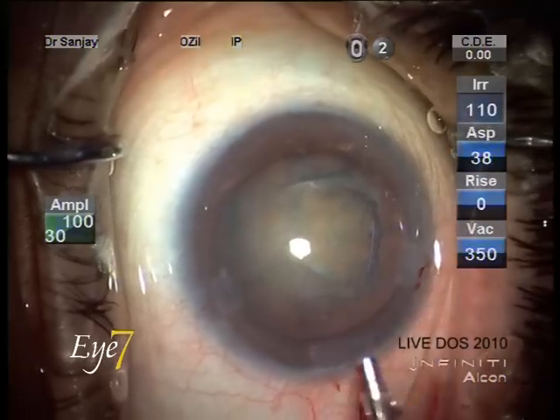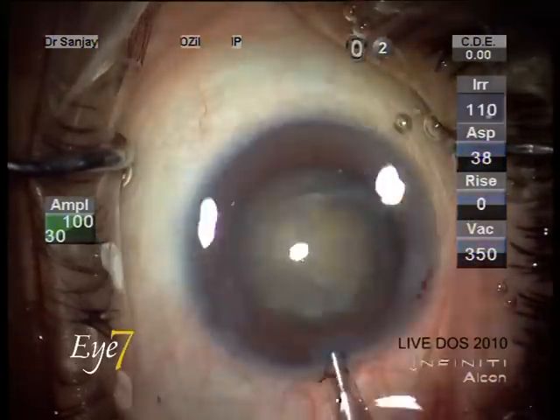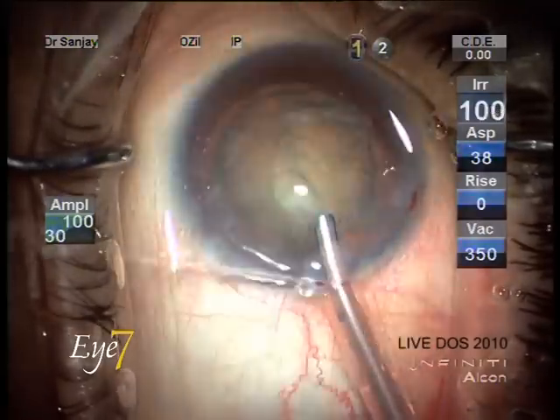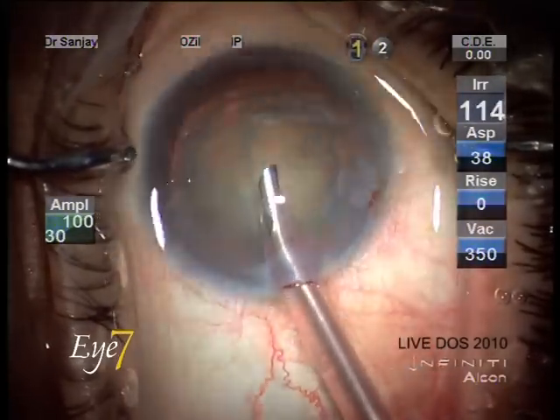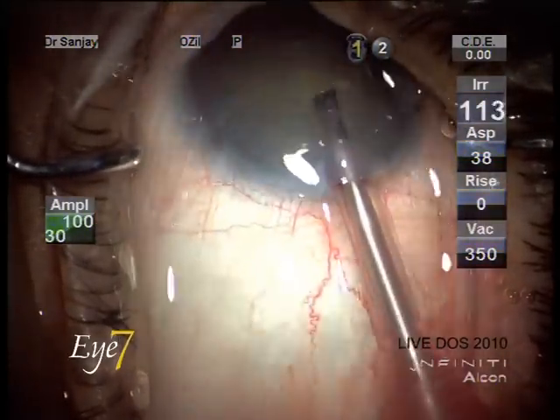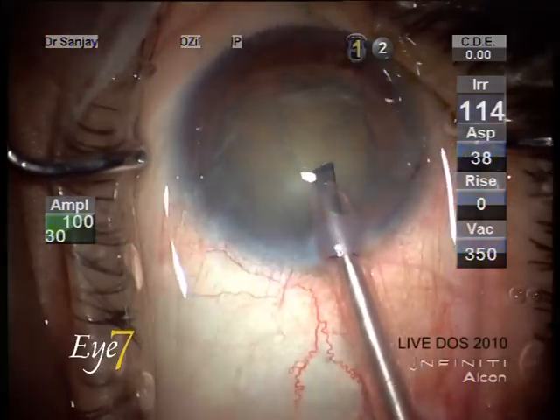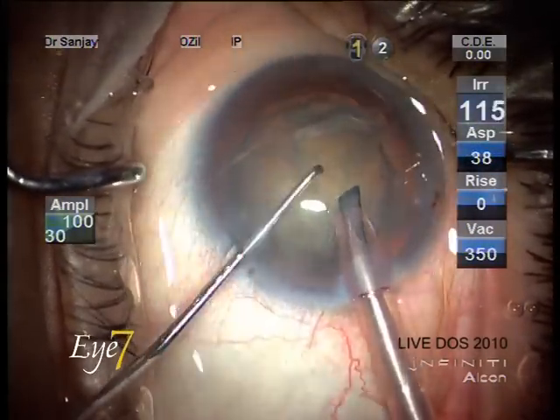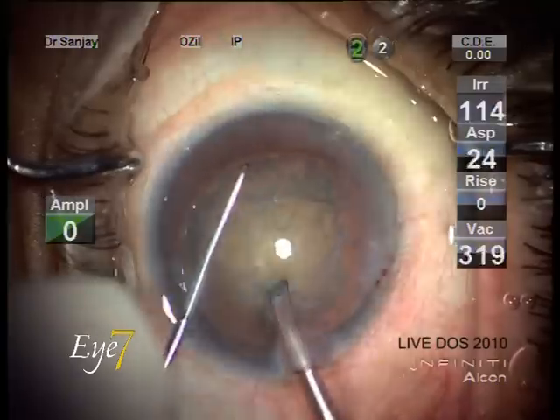This is the phaco tip covered by a phaco sleeve. The phaco sleeve is pink, indicating this is a micro phaco sleeve which goes through a 2.2 millimeter incision. The phaco tip is a Kelman tip — a bent Kelman tip.